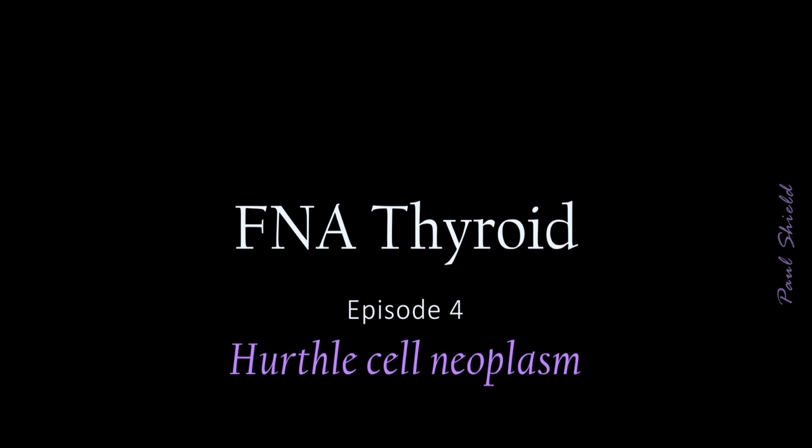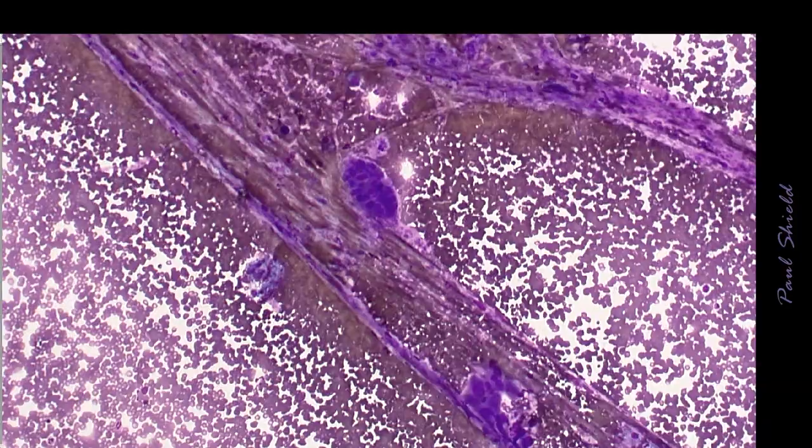Hi, it's Paul. Let's look at Hurthle cell neoplasms of thyroid. So these are follicular neoplasms that demonstrate Hurthle cell differentiation. We'll just look at a case that's a pretty typical example.